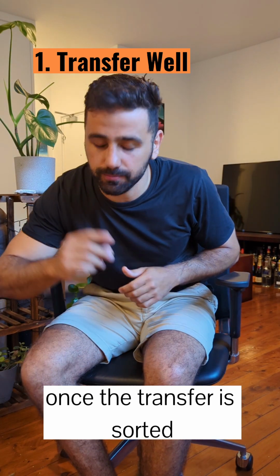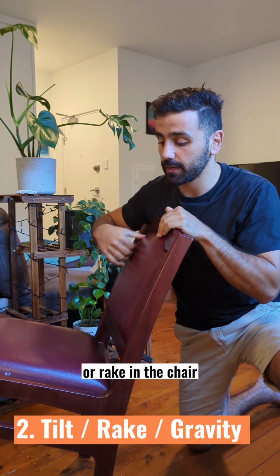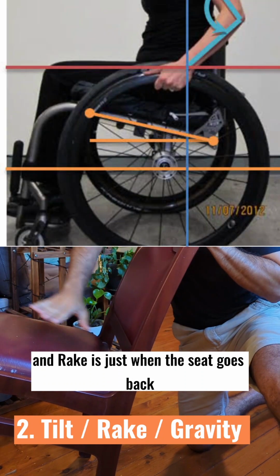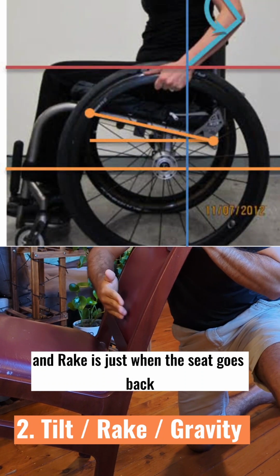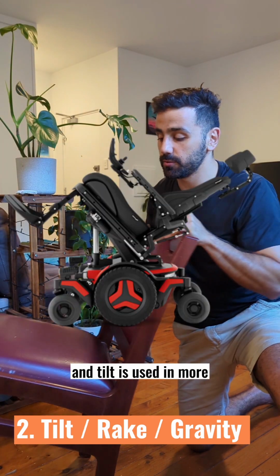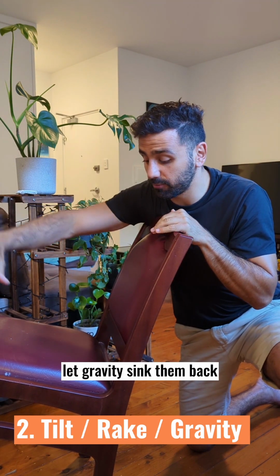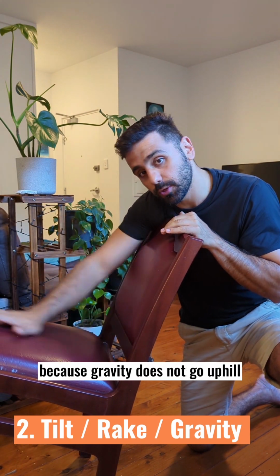Once the transfer is sorted, now you can look at the chair. Number 2, first thing you want to do is use tilt or rake in the chair. Now tilt is when the whole chair goes back, and rake is just when the seat goes back, but then the backrest would be up. So rake is more used in a manual chair, and tilt is used in more tilt-in-space chairs or power wheelchairs. Gravity is your friend. Let gravity sink them back because gravity does not go uphill.